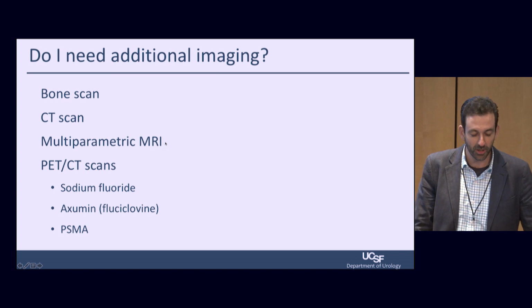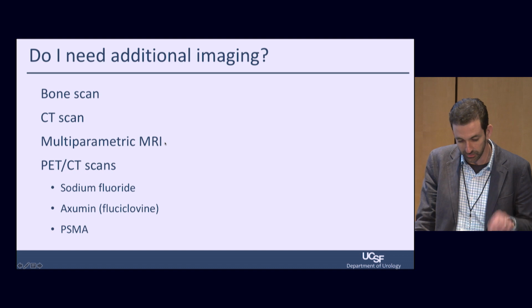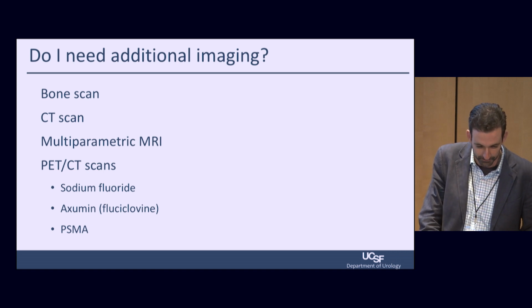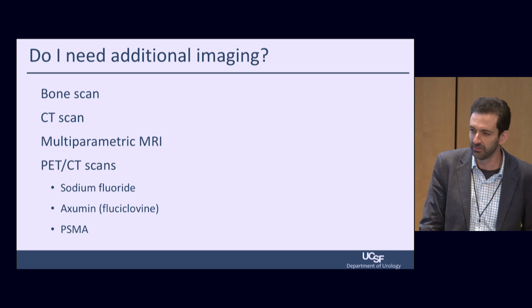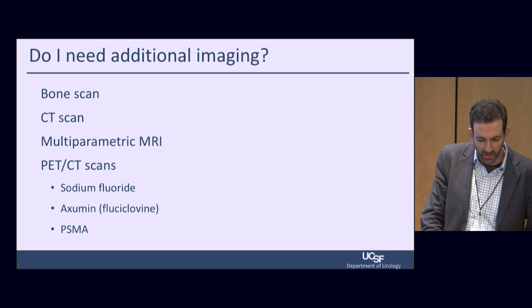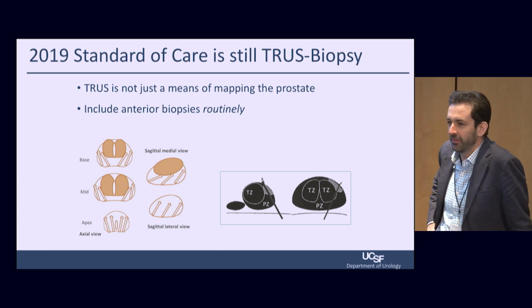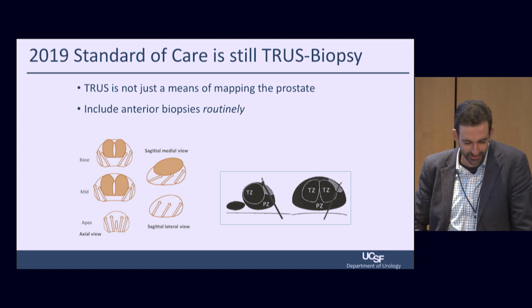Now, multiparametric MR, we are doing more and more. It gives us a look at the lymph nodes, but it's also a good way to look at the tumor itself and give us a sense of the extent of the cancer and whether it might be outside the edge of the prostate. And then PET scans we will be talking about. These are gradually replacing, I think, bone scan and CT as more sensitive, better ways to look at the whole body. Now, for all the talk about MRI, if you go to our annual meeting, the American Urologic, I think you would come away with the impression that everybody with a prostate needs an MRI at least once a year, and then we will have no problems with prostate cancer.